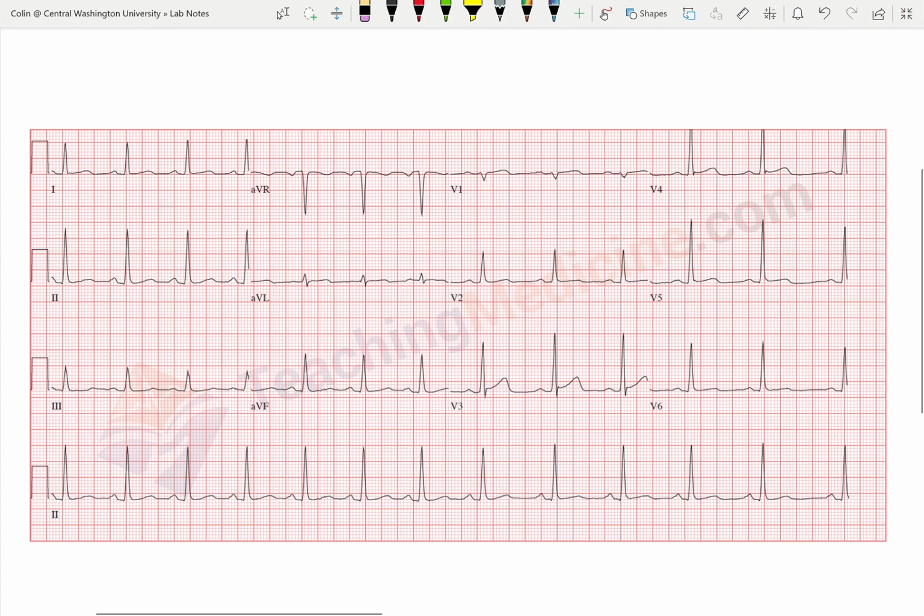And again, this is stuff that if you ever went to medical school, you need to have down, because when we call the doc, and I'll explain it later, we need to tell them what part of the heart is having an issue. We need to build the case that these people are having a heart attack in a certain area. But for now, I want to kind of demystify why there's all these different numbers.